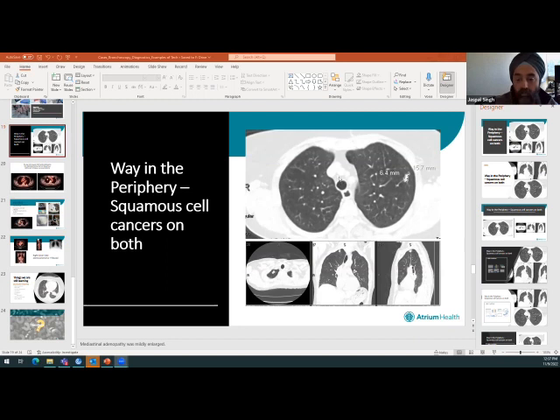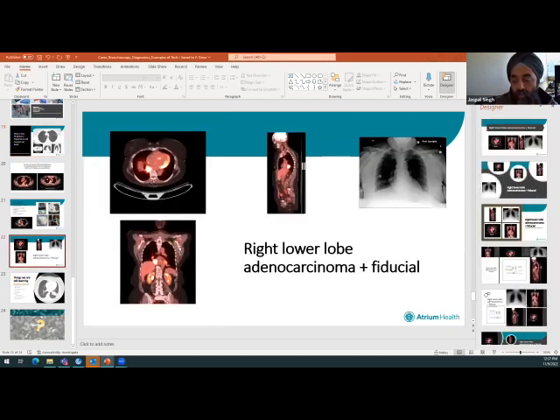That patient I told you about yesterday, this is pretty much as deep as you get. You can go way down, almost touching the diaphragm and the heart border. That bronchoscope is extremely thin and tiny, and it can reach into a really tough corner pocket. So you can get pretty deep in there. Because of that, you have to be careful. Someone asked earlier about who should go. This is where, to be a good operator, you also know when not to go there.